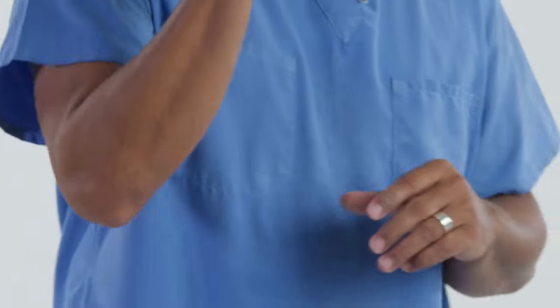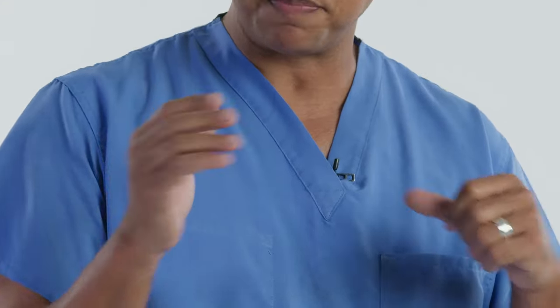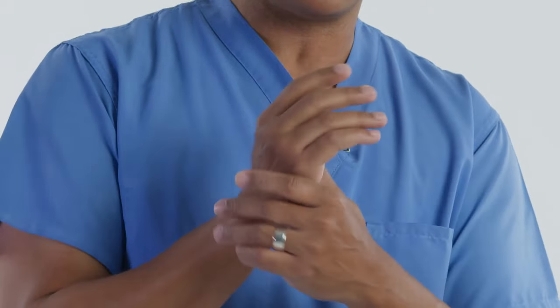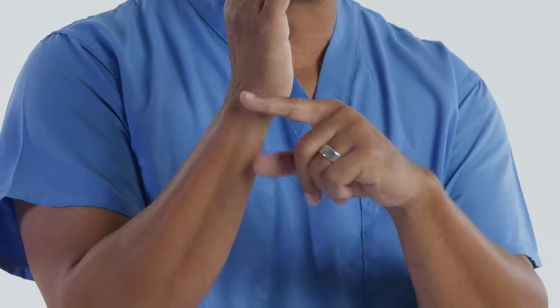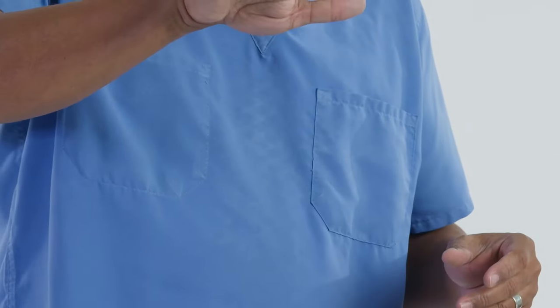The patient's injury is around the fourth and fifth metacarpal area — it is impacted or angulated. We're going to concentrate on getting that wrist at 15 to 30 degrees of extension, and at the metacarpophalangeal joint we're going to get that at 45 to 90 degrees depending on what the provider wants, because we're going to have these fingers together for a period of time.